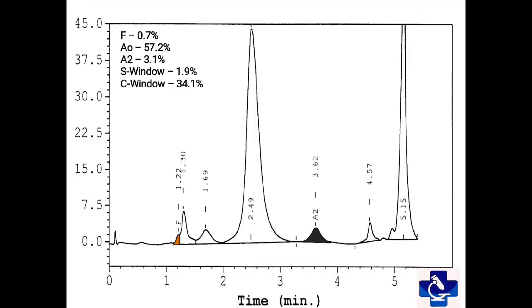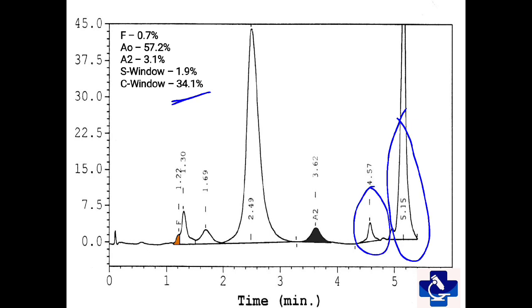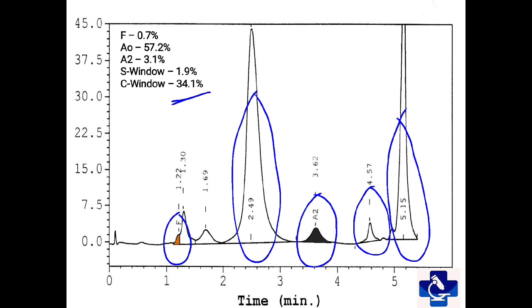In this HbC graph, we can see around 34% of hemoglobin falls in the C window. The S window has around 1.9%, A2 is normal at 3.1%, and we have an A0 of 57.2%. Fetal hemoglobin is normal. In the S window, we have the glycated fraction or post-translationally modified hemoglobin C. This graph is that of hemoglobin C heterozygous.